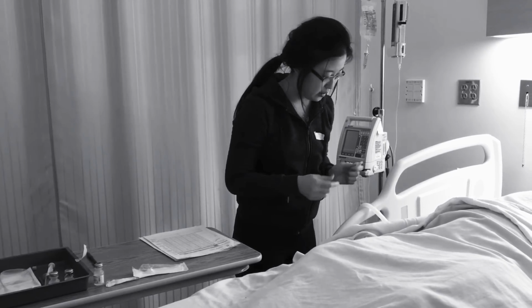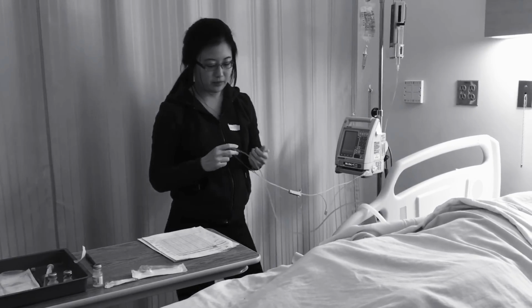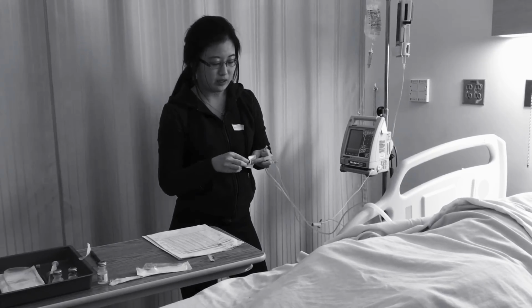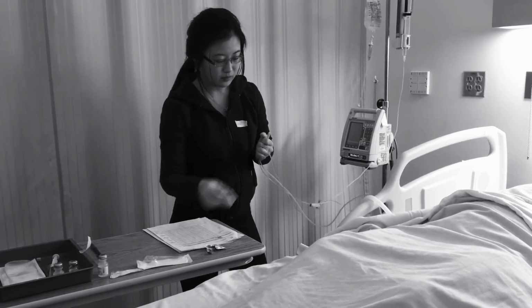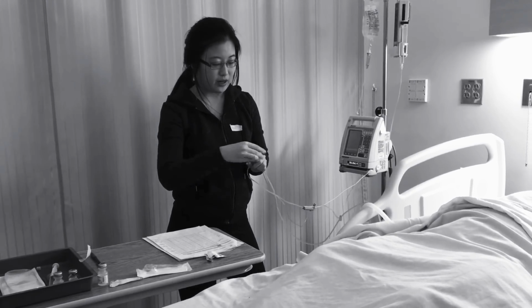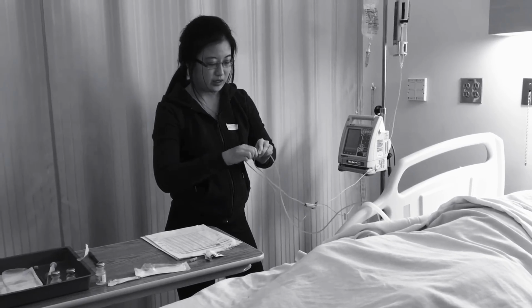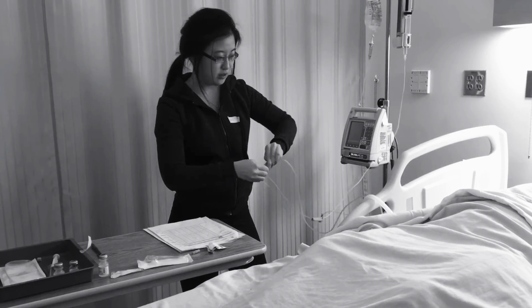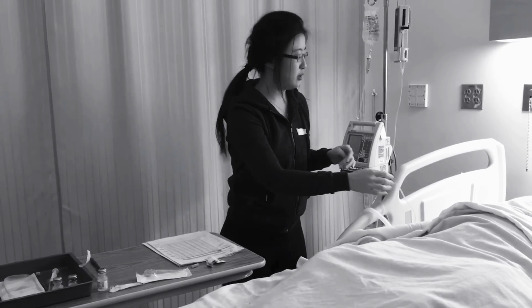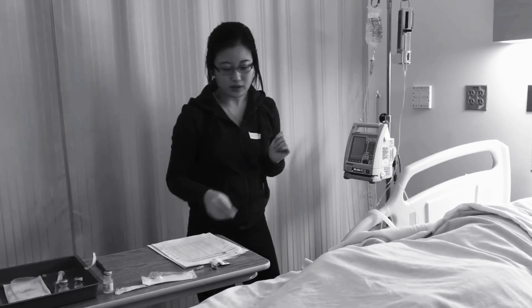So now I'm going to connect it to this port, the middle one, just so we have the closer one for IV push meds. So I'm going to swab this for 30 seconds as well. Let that dry. Uncap that. And connect this to that. So now that's connected, I'm going to press start. And it's the normal speed, which I said before.